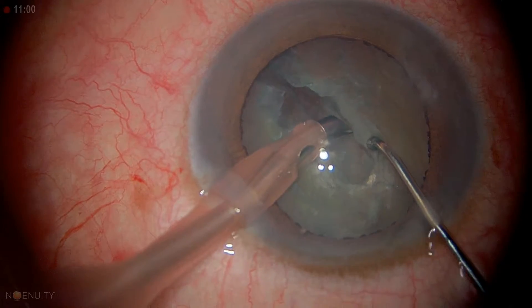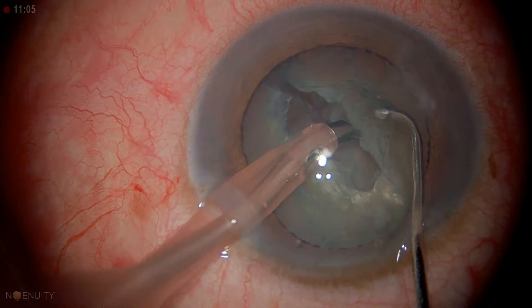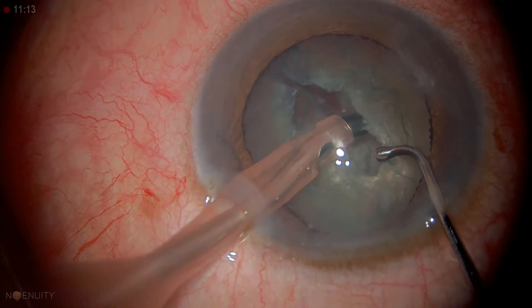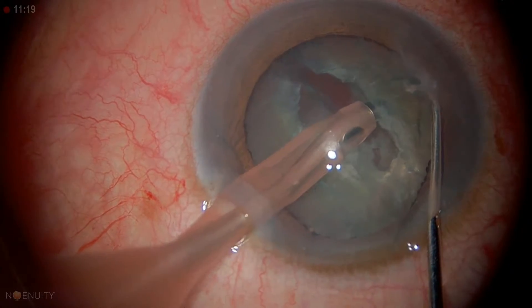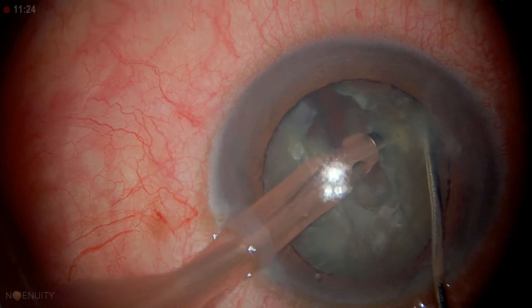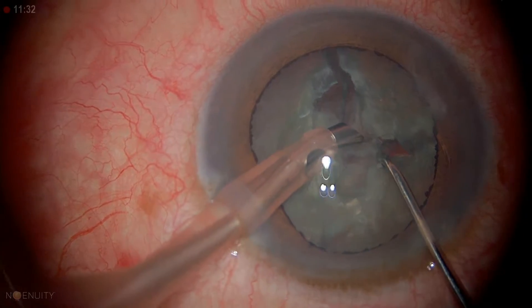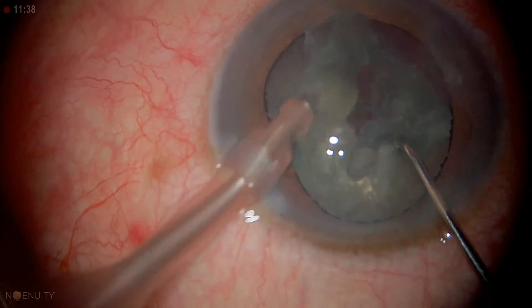This is a different setting. We're going to engage the nucleus, pull it toward us, and put this chopper underneath. This is a horizontal chopper — you can see it's blunt at the end. We engage the center, get behind it, bring it toward you, and chop the piece.